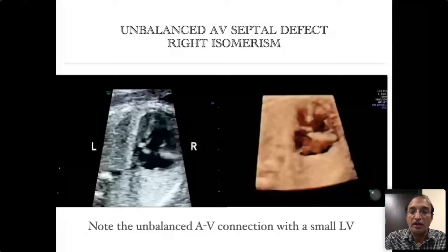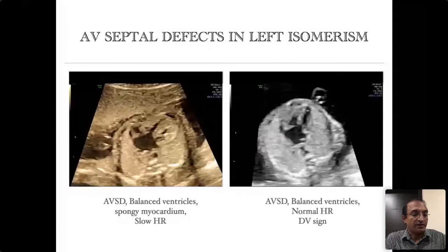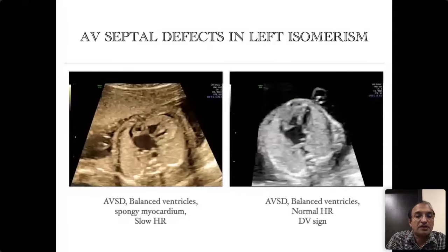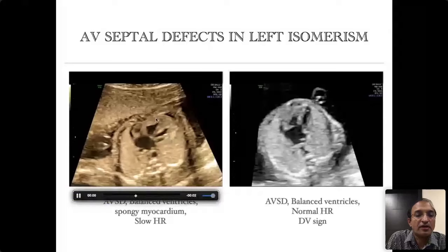This is another type of AV septal defect where you see two good-sized ventricles, but notice how slow the heart rate is. This is typically the type of AV septal defect found in left isomerism.